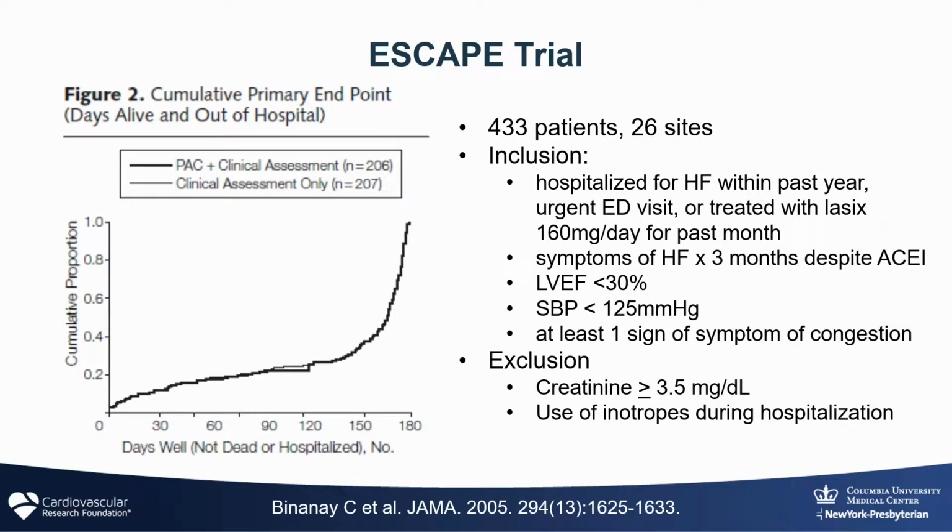And I think there are some prospective data that show that if you put these catheters in patients that don't necessarily need them, you're not going to get a benefit from these catheters. And that was shown in the ESCAPE trial. These were not shock patients, importantly. But for some patients with decompensated heart failure at a variety of stages that are not that severe, you might be able to manage these patients without a PA catheter.